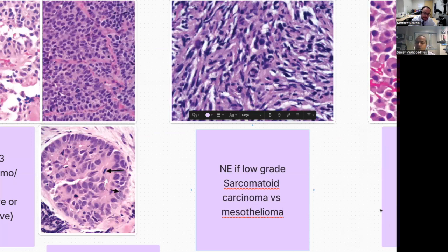So if it's keratin positive, your differential is between two things, and in those two, where the mass is located is the most important thing. Now, if keratins are negative, then you have to think of sarcoma. What I do is show it to our sarcoma people, but don't do a Vimentin. That is not your friend here.